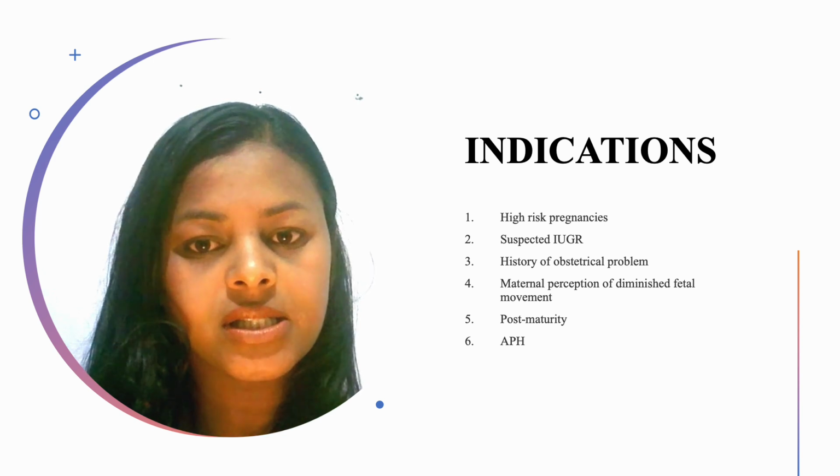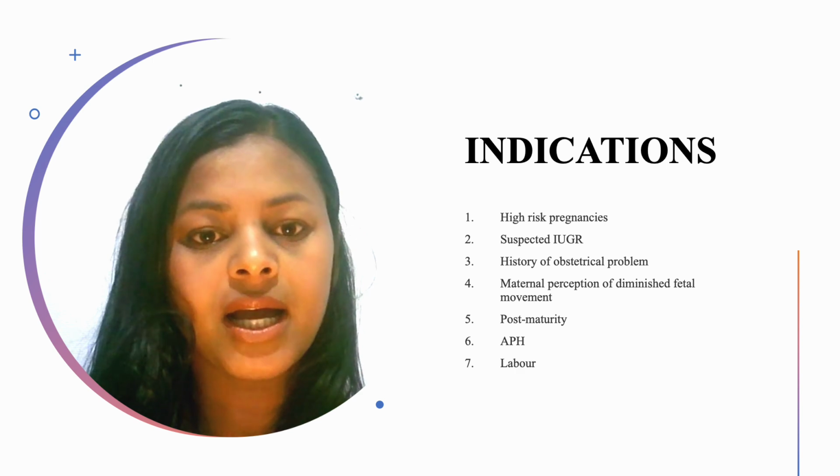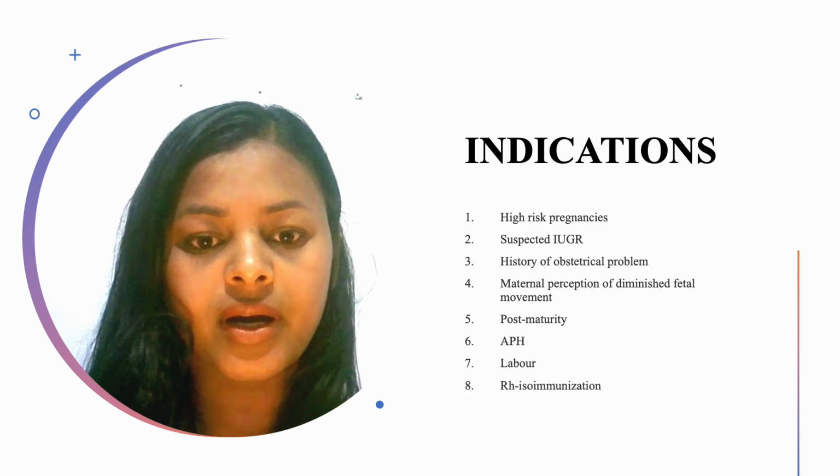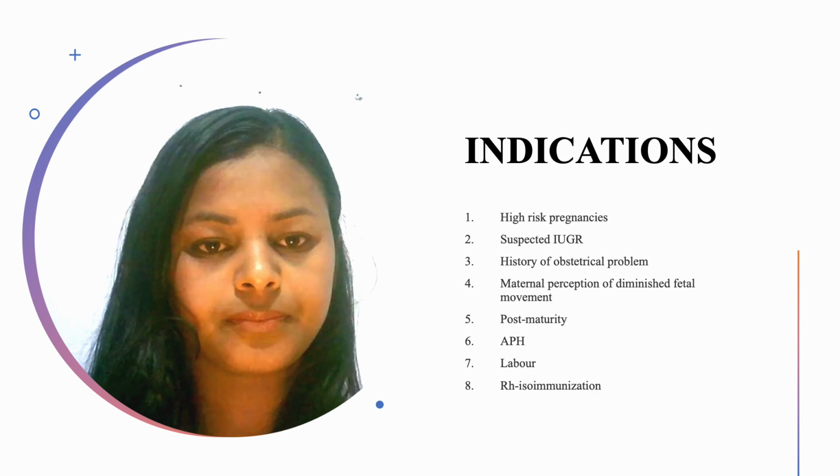We do the CTG during labor and if the woman has a negative blood group and is at risk of isoimmunization incompatibility.